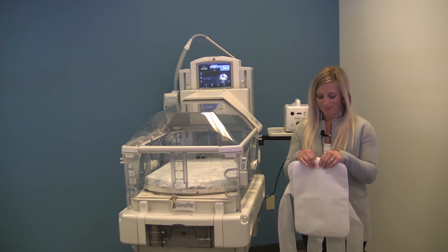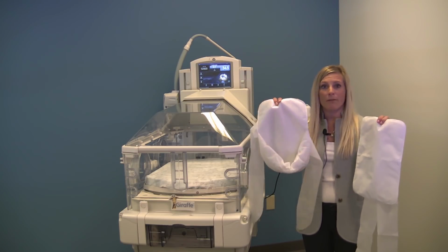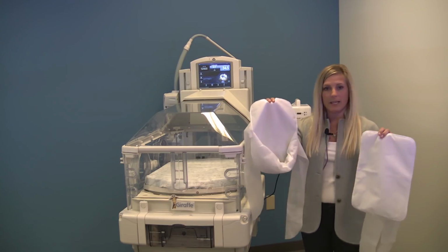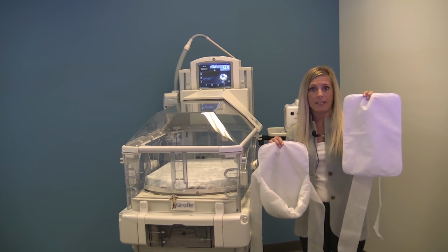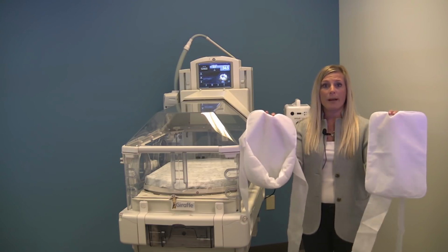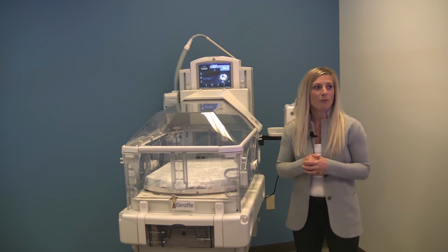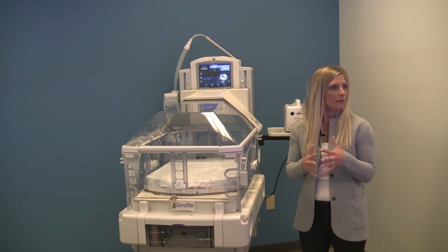Okay, thank you. All right, so we'll kind of get back to the nest versus the pad. And again, it's really baby preference, right? So I say user, but the baby's the boss. So this nest provides boundaries. So personally, I choose the nest because most of my babies want boundaries. Maybe those bigger kids don't need the boundaries and a flat pad will suffice. Either one swaddles in a blanket nicely. So it's again what that baby needs, and you're good with either choice. So hopefully that addresses some of that confusion if there was some. And I think that covers the pads and then the covers. So yeah, I think it does.